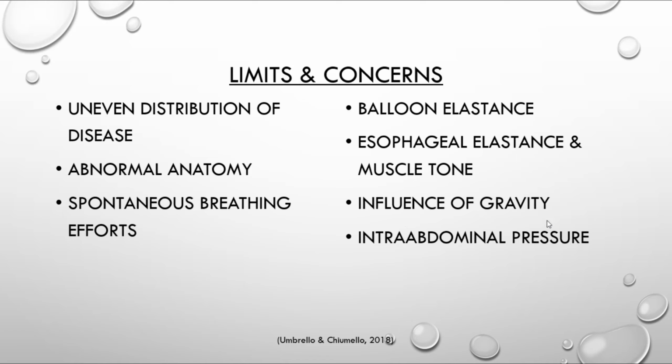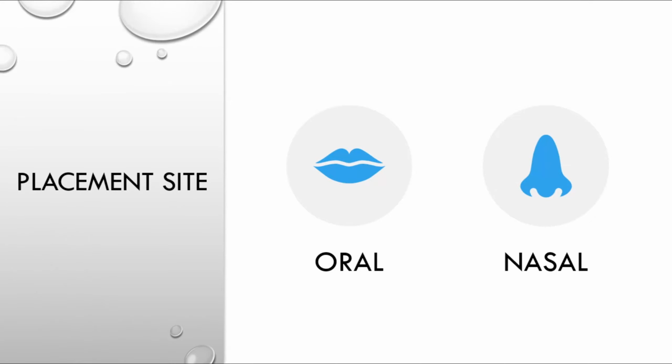Back to gravity, this could be patients on CLRT, or maybe we're proning a patient. You just want to keep that in mind when we're taking our readings.